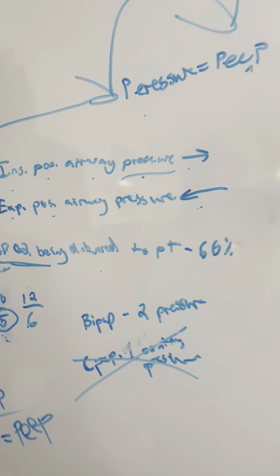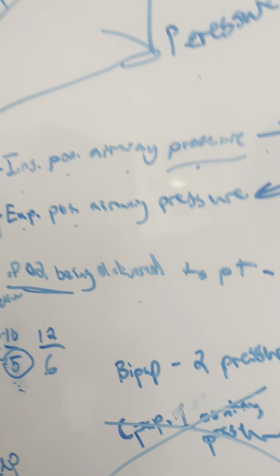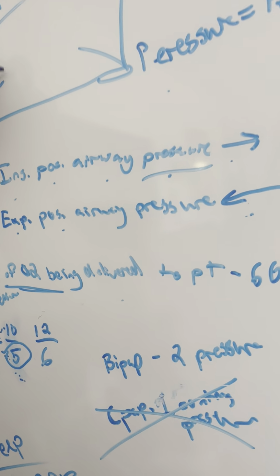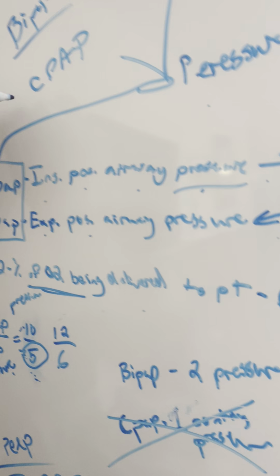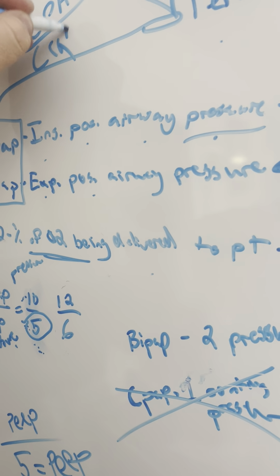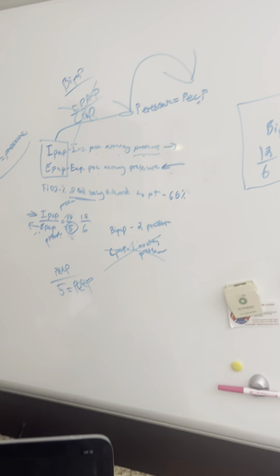Once you start using Bipap, CPAP is crap. I promise you. CPAP will be out when you start figuring out Bipap.